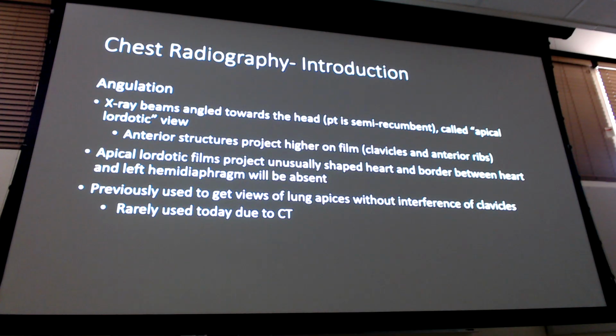Angulation. Somebody asked me this on the break. Are we shooting the x-rays? Which way is the x-ray pointing? So for a chest x-ray, it's a horizontal beam, straight at the patient. There is no angulation of the beam. However, sometimes we will do it on purpose.